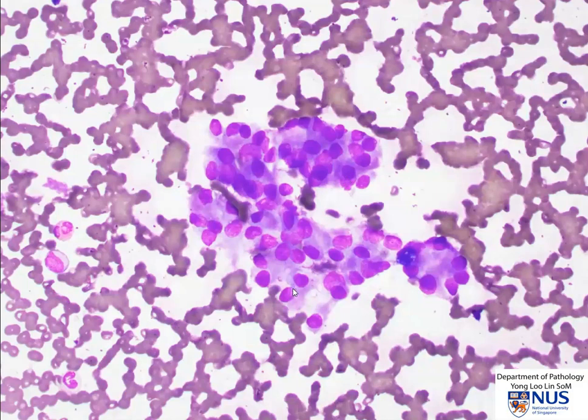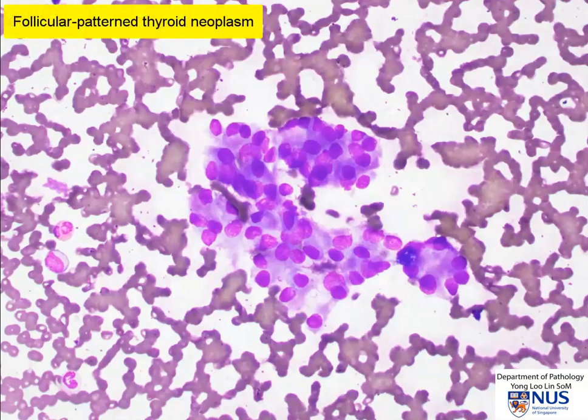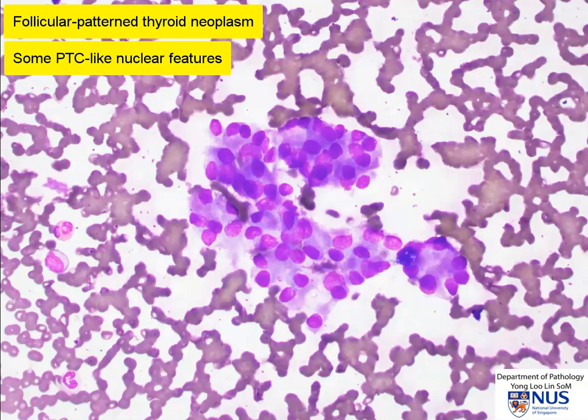So what we have here is a follicular patterned neoplasm with some nuclear features that are worrying for papillary thyroid carcinoma. In this instance, because we do not have the full house features of a classical papillary carcinoma, such as large syncytial sheets, papillary tissue fragments, and fibrovascular cores, it is difficult to make an outright diagnosis of PTC because we know that there's a possibility of differential diagnosis.